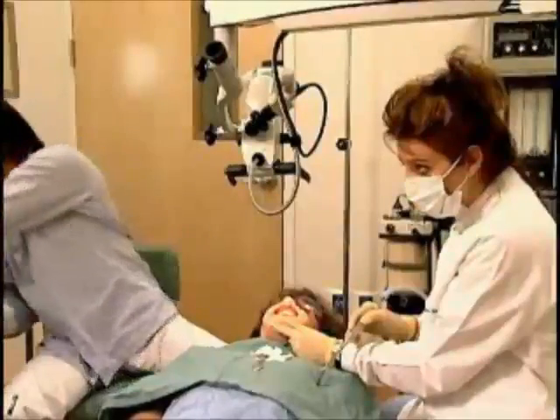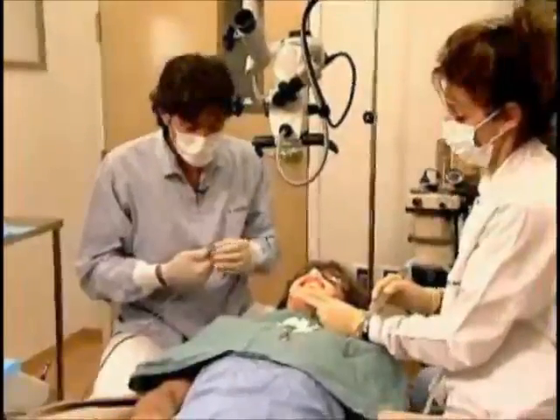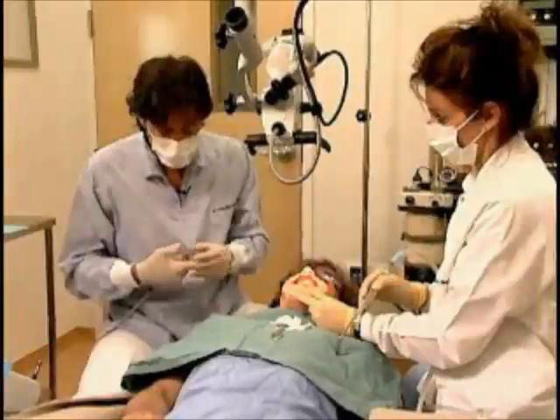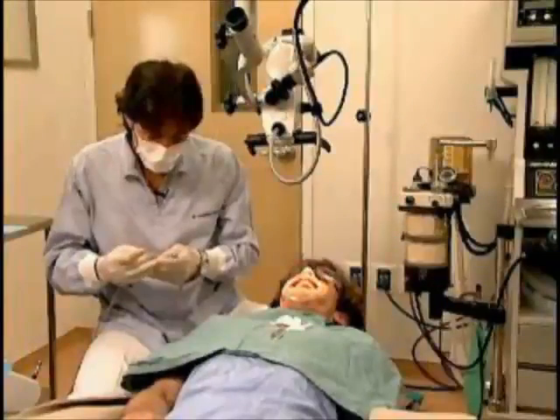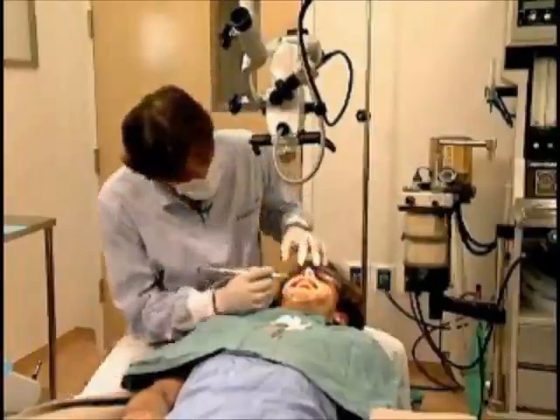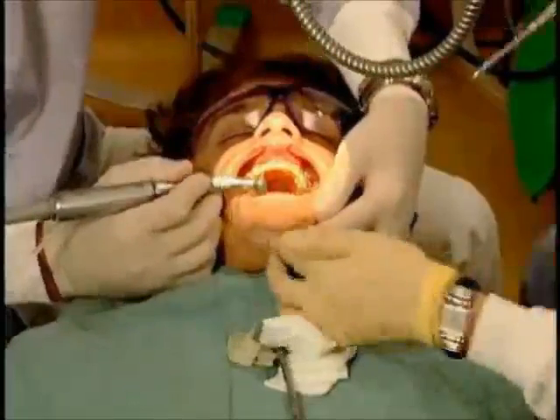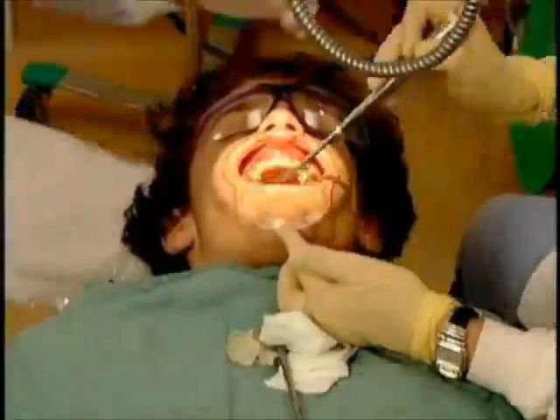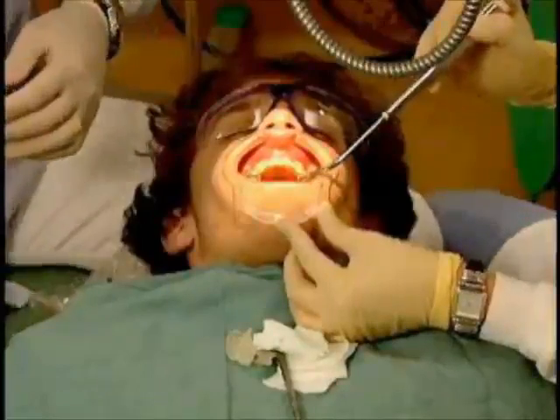What we're going to go ahead and do is proceed with the placement of the implants based upon the CAT scan. We're going to utilize tapered screw vent implants from Zimmer for the lateral incisor replacement, and we're going to go to about 16 millimeters in length. We have available bone for that, which will give us good immediate stabilization, and we're going to need a little bit of depth, and we're going to use just as a guide for the placement of the restoration. I want to place it right in this angulation, so I'm just going to start the process of drilling the initial access based upon our CT scan, which gave us all the information.